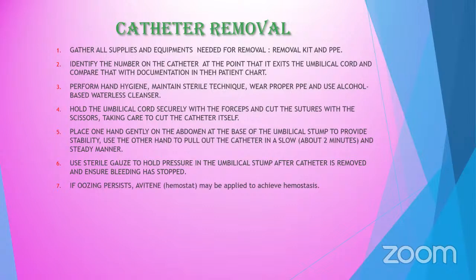The next is if oozing persists, a hemostat may be applied to achieve hemostasis. So we have guidelines for controlling oozing. We'll speak about oozing in those separate guidelines.